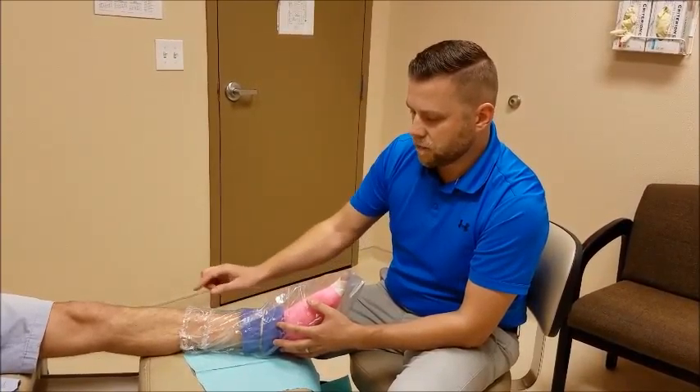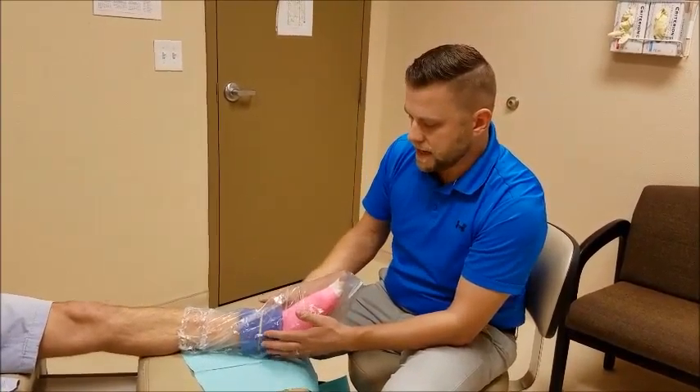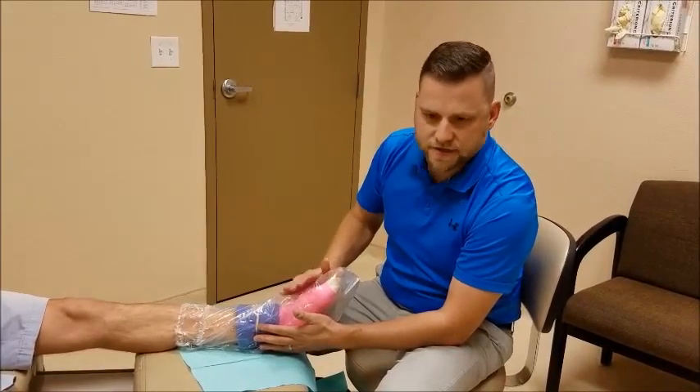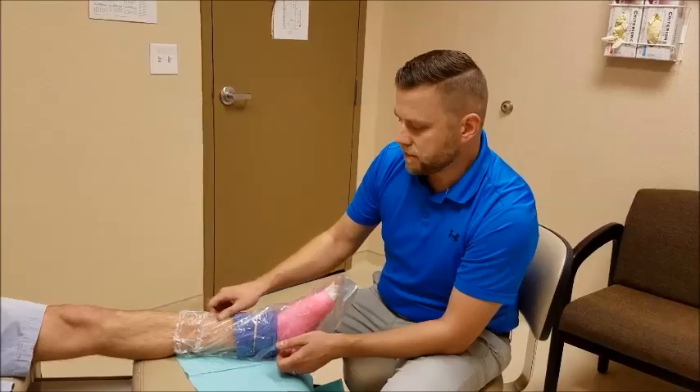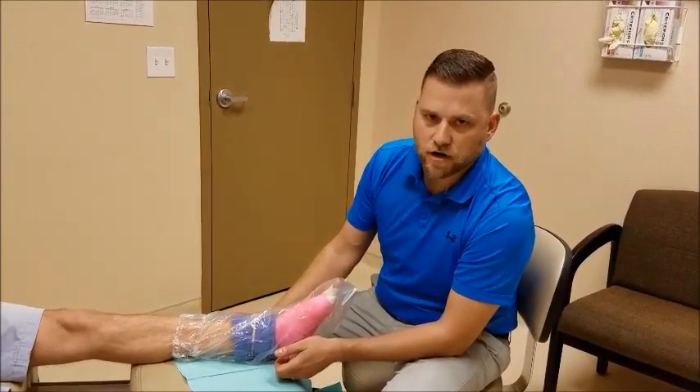When you're done, take it off and let it air dry. If water ever gets inside and gets beyond the towel protecting the cast or dressing, call us immediately so we can remove it. That's how you use the Protex shower cover.